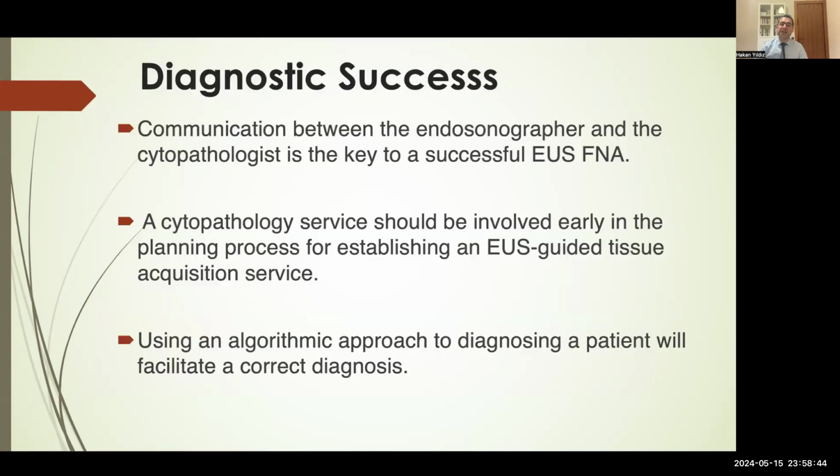Diagnostic success and communication between the endosonographer and the cytopathologist is the key to successful EUS FNA. A cytopathology service should be involved early in the planning process for establishing an EUS guided tissue acquisition service. Using an algorithmic approach to diagnosing a patient will facilitate the correct diagnosis.